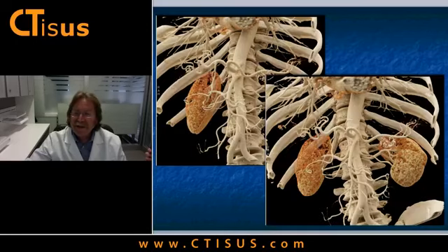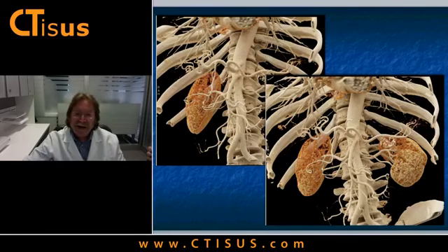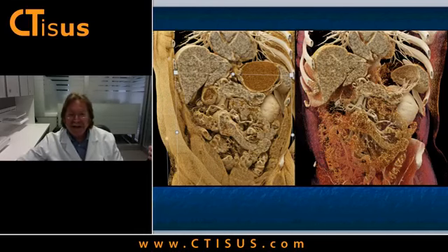And then here, that same patient, now I'm just simply changing the parameters, and I'm showing you the vascular map, which would be important preoperatively. You see the close relationship of the tumor to the patient's splenic artery. You see the celiac and hepatic and splenic. You see the GDA, off the hepatic, and the SMA. Vessels nicely defined. And then here is just one more view where I'm now accentuating a little bit the bowel, the tumor in the coronal plane, the stomach and spleen. So you can see the cinematic really takes that simple axial image and adds a lot.